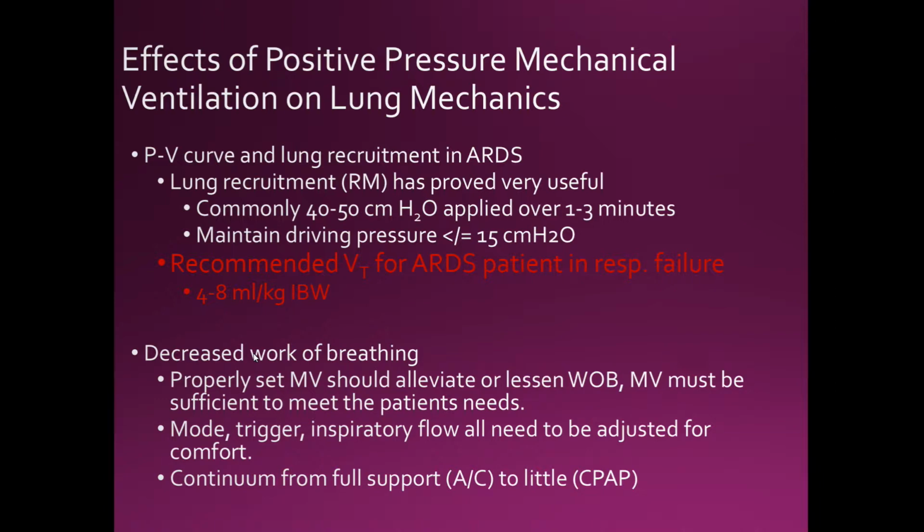If you set the trigger, again, they're at plus 5 PEEP, they're auto-PEEPing at 8, so at plus 8 is where they are right now in terms of their baseline. You will set the trigger to, hold on, let me think about this. Yes, that's right. You would set the trigger at 7. That's still a difference of 1. 8 minus 7 is 1. So if you had it at negative 1, that's easy for the patient to trigger.